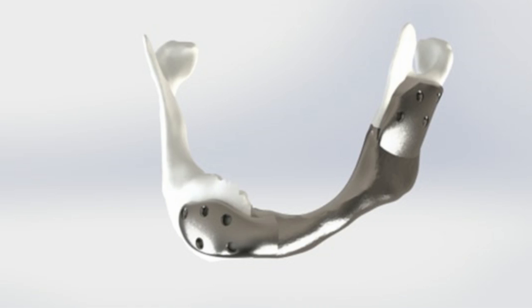Tumors in and around the lower jaw are often treated by removing part of the jaw bone. The mandible is reconstructed, if possible, with bone from elsewhere in the body, usually from the fibula, a small bone from the lower leg.